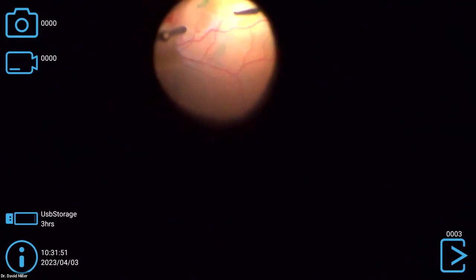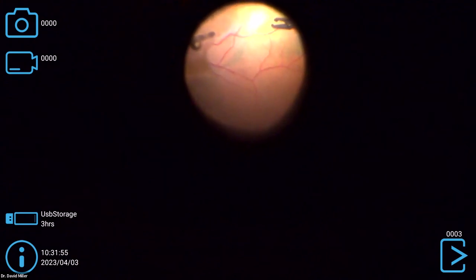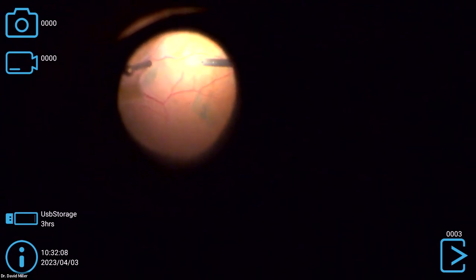ILM in a PVR case like this is a little more difficult to peel, tends to be more sticky, doesn't like to separate quite as well. It comes off more piecemeal typically. So we're in pretty good shape. Homogeneous staining like this, a nice even stain, kind of shows you there's no residual ERM out there. There's probably a little bit down here, but we're pretty remote from the macula. We see no traction, so I'm not worried out here. I'm not worried over here because there's no non-staining area.